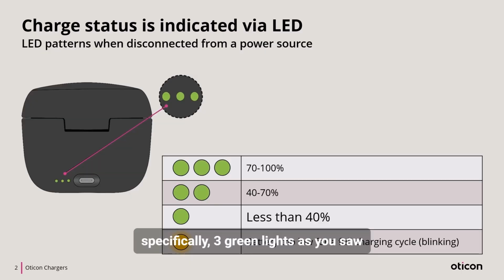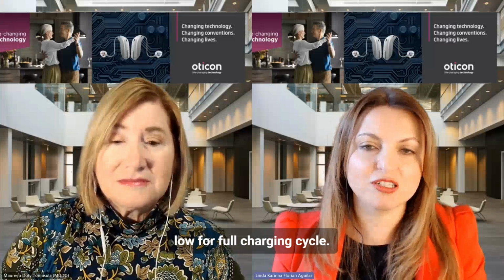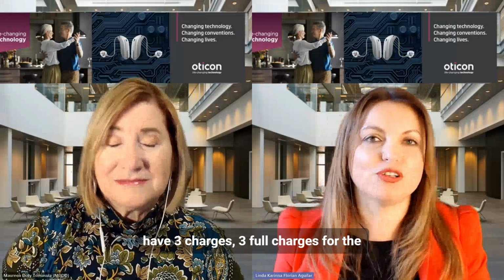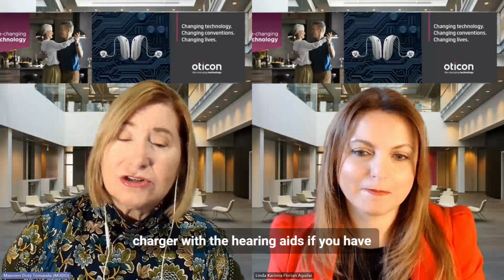So, more specifically, 3 green lights, as you saw before, indicate 70 to 100% of the capacity to charge. 2 green lights indicate 40 to 70%. 1 green light indicates less than 40%. And a yellow light indicates that the battery is too low for a full charging cycle. With the older smart charger, we had 3 full charges for the hearing aids, but as you can see, now it's different.